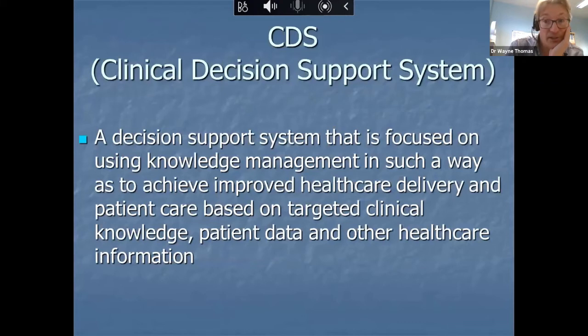So one of the things, which certainly with Abbott, again, another exciting development, is using all of that information, the information from all of the tests that we do, that potentially will reflex test. So if you have an anemia with a hypochromia, you get a ferritin, or a transferrin saturation, or a blood film. Effectively, it's using algorithms, using evidence from the literature to build up a plan of attack. If the samples are there, they can reflex test and add on.